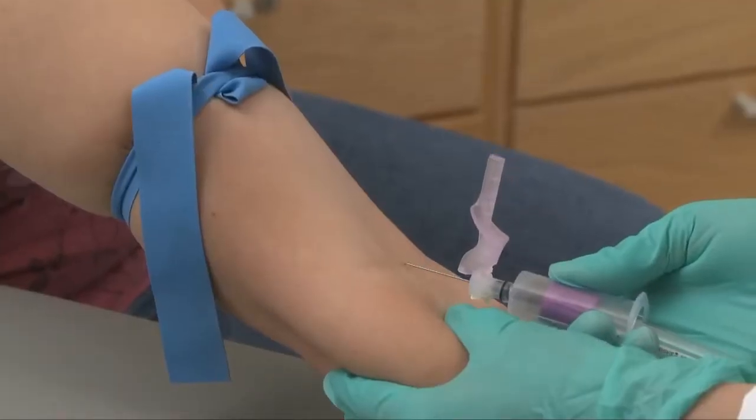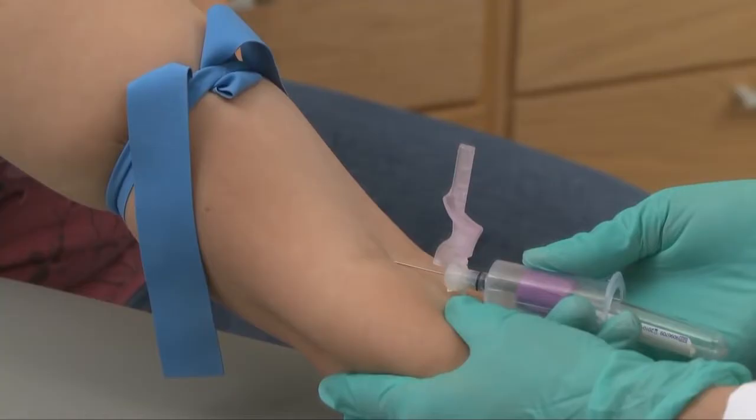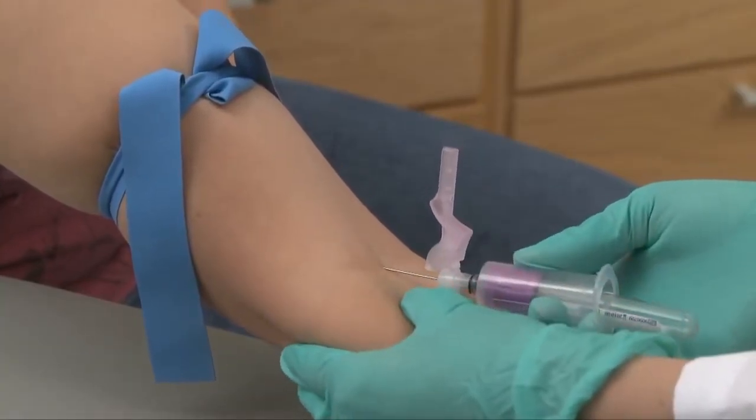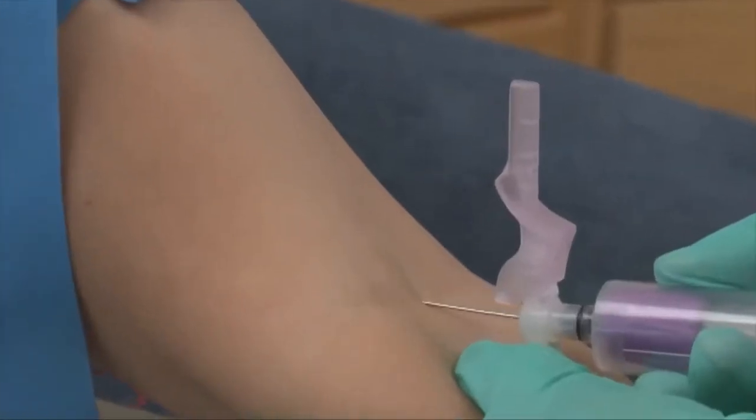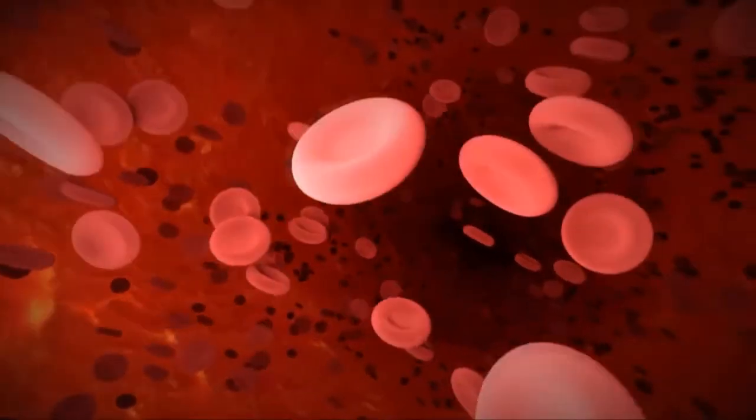Position the needle bevel side up and line it up with a vein. Position the needle so that it forms a 30-degree angle with the surface of the arm. With a single, short, but firm motion, swiftly insert the needle through the skin and into the vein. Push the evacuated tube onto the needle when the needle enters the vein. As the vein aligns with the needle, blood will begin to move out of the vein up into the needle. Maintain a constant, slight forward pressure on the end of the tube.